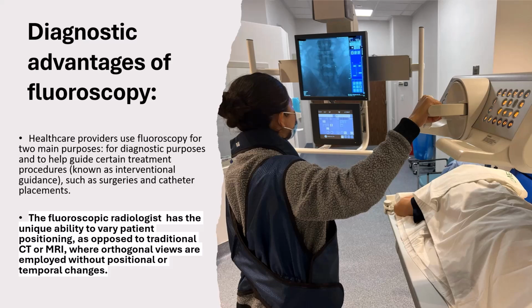Healthcare providers use fluoroscopy for two main purposes: for diagnostic purposes and to help guide certain treatment procedures, such as interventional radiography procedures and intraoperative surgical procedures. The fluoroscopic radiologist has the unique ability to vary patient positioning, as opposed to traditional CT or MR, where orthogonal views are employed without positional or temporal changes.